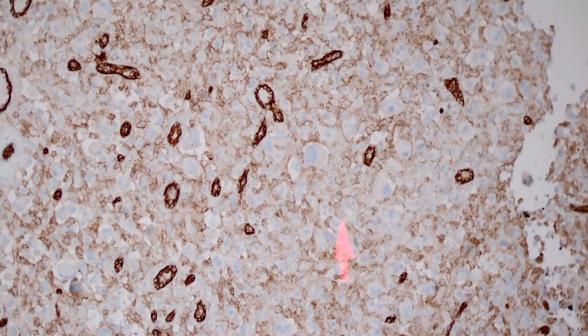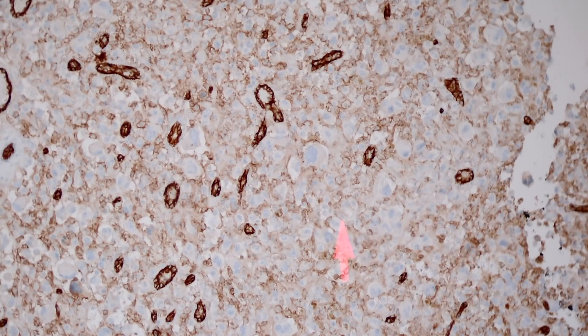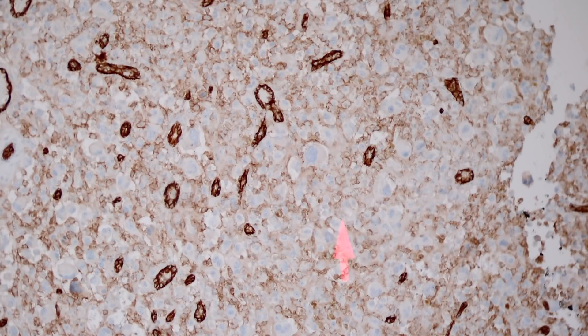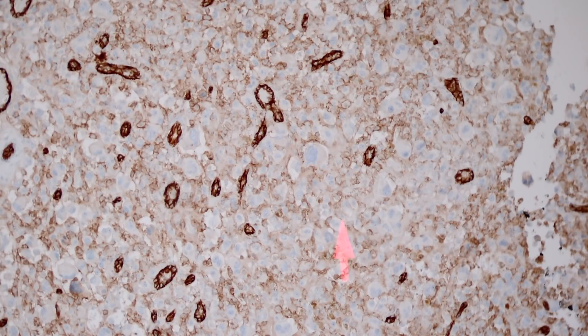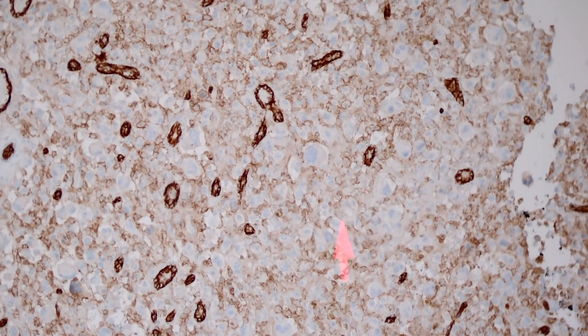CD31 can be picked up in a weak, granular manner by histiocytes and occasionally by tumor cells. That's the 5-Minute Pathology Pearl for this video.